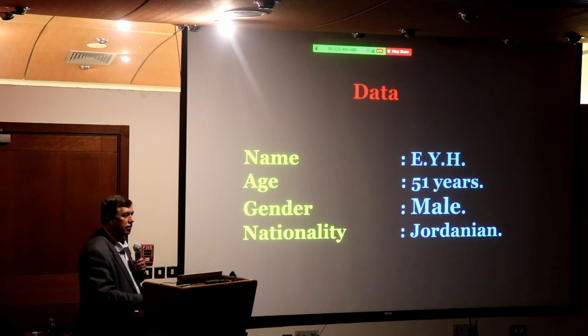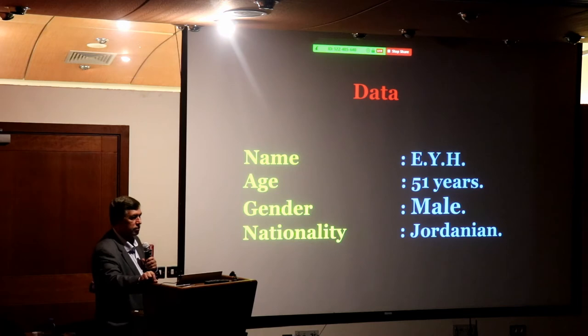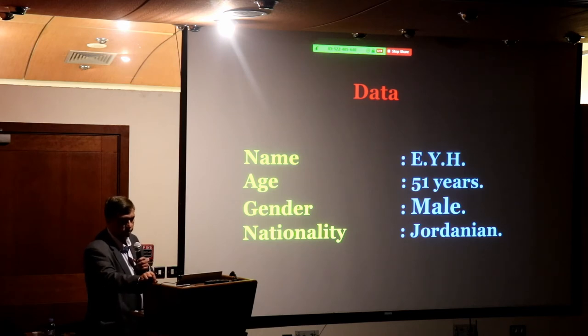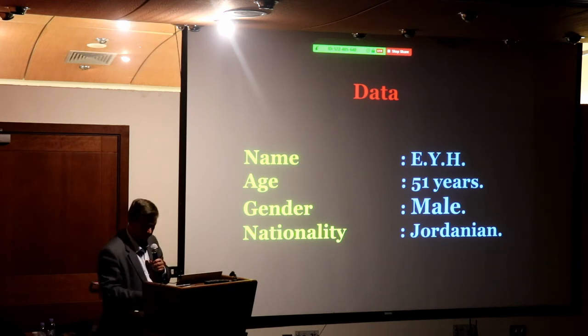What's the material of the coiling? Most of the time it's platinum. But one thing that changed dramatically between before and now: most of the clips before were some form of metal that would prevent the patient from having an MRI. Now things change. For us, it's always MRI safe, and I'm mentioning that for every radiologist. So platinum is the largest component of that metal inside it. So the clips and coils are now MRI compatible.